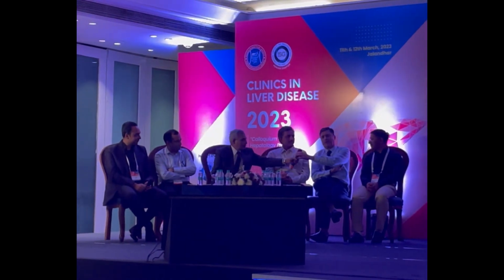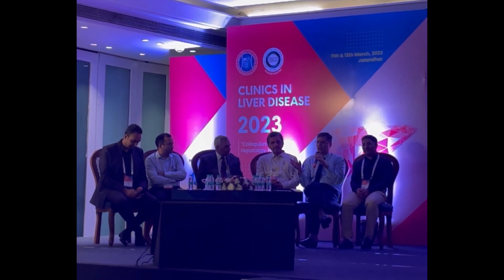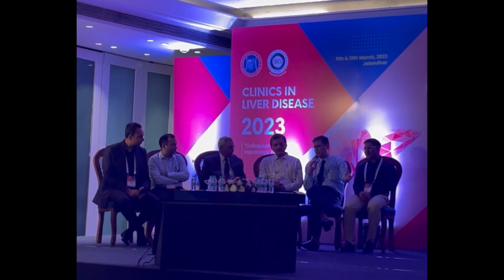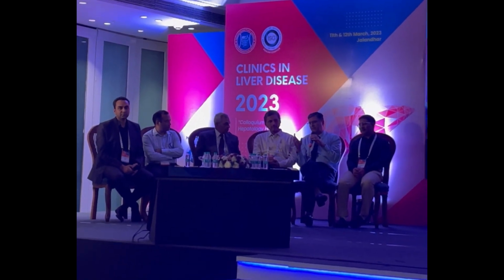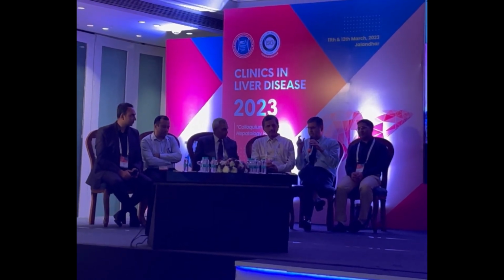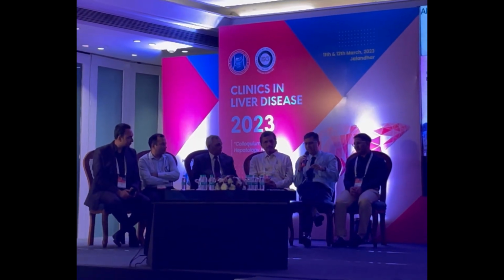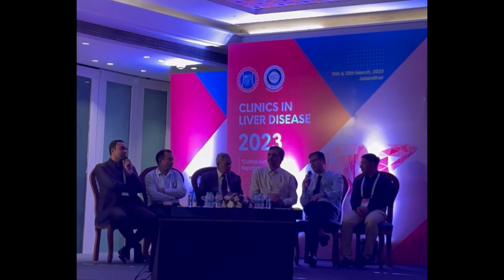Yes. I have used both the machines a significant number of times, but not within the same patient. Like you said, a head-to-head comparison; it's not like I did it on FibroTouch and then the EchoSense machine on the same patient. But my experience has been that the values are almost similar. There might be a difference of 2-3 points. But as a hepatologist, if you are using it in your clinic every day, you must be aware of that. Within the same patient, if you repeatedly use the same machine, you will get right results. But if you compare it with a different technology, yes, there is a difference of 2-3 points. Being a clinician, you have to be aware of that.